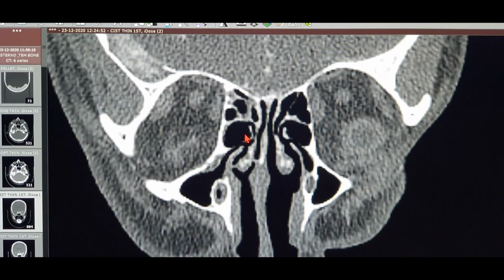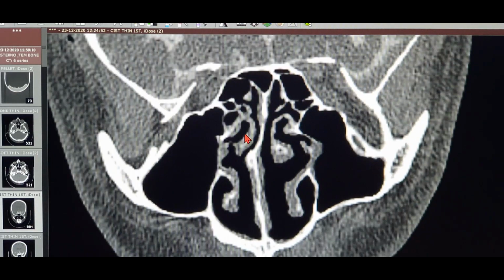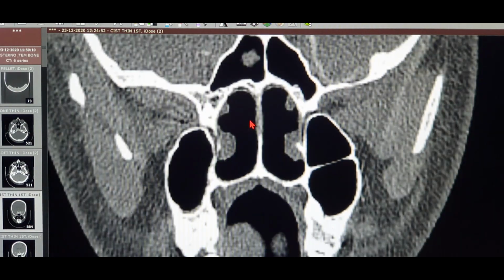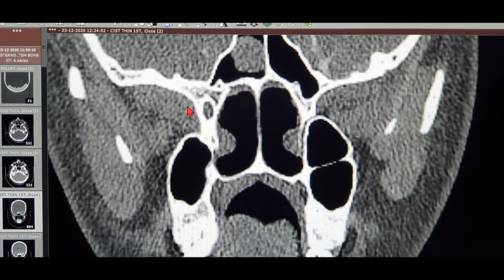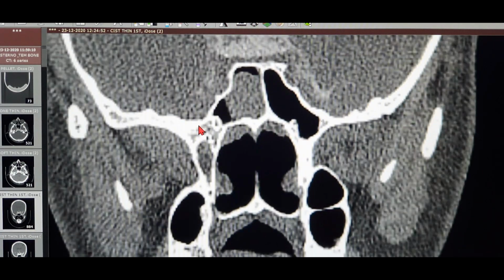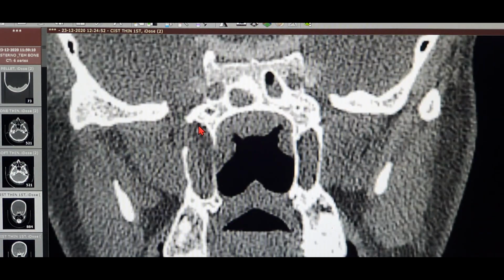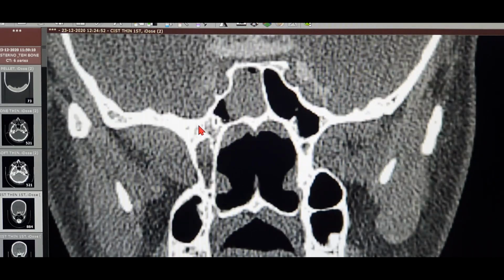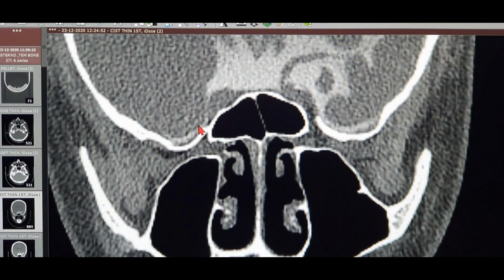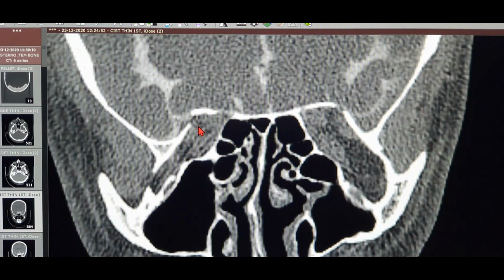Although we do see that the patient's sphenoid sinus is having a lot of collection as well. So far, mostly in the posterior aspect. As you can see, a small collection area in the posterior aspect of the right sphenoid. So this could be the collection in that sphenoid sinus. Apart from this, everything seems to be quite normal in the patient's CT cisternography.